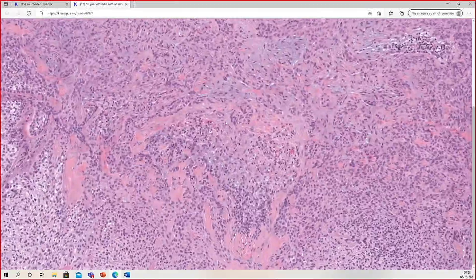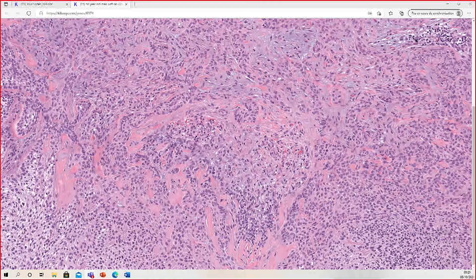The concept here is useful because multiple different skin adnexal tumors can do this. You tend to see it in trichilemmoma very often, but you can see it in sweat gland tumors like hidradenoma too — if one of the cysts ruptures, it will look very busy and infiltrative. But on low power of a whole excision, you can tell the periphery is very smooth. It is a pseudo-infiltration — a fake infiltration. It's not really infiltrating; it just looks like it in the middle.